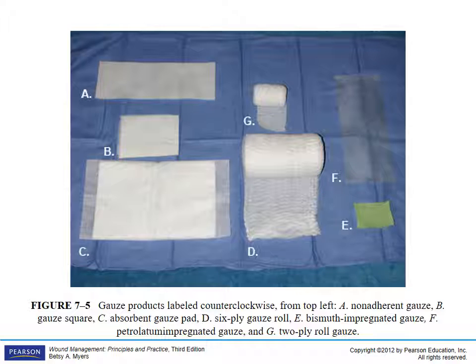G is also a gauze roll. So again, depending on if you need D, which is a larger version, or G, the smaller version. E is a bismuth impregnated gauze. So what that is, is a gauze that's impregnated with betadine type of solution. So it's antimicrobial. And then the F is also a petroleum impregnated gauze that, like I talked about in A.